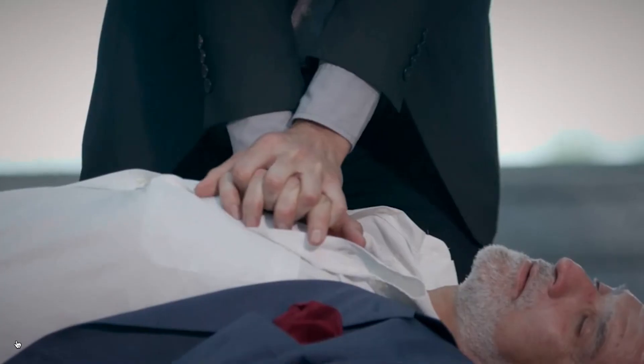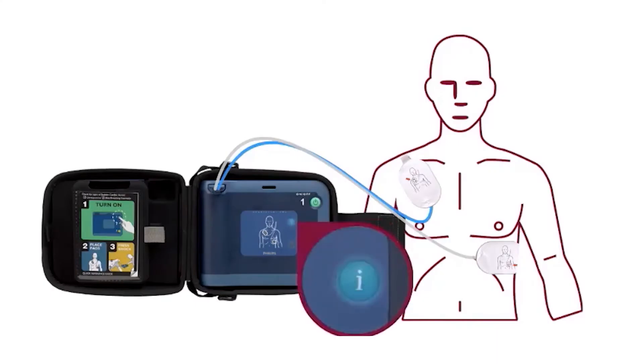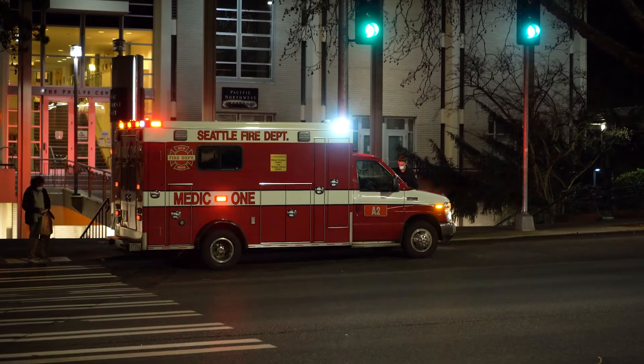If CPR instruction is needed, the user can press the blue I button to receive coaching from the device. If the HeartStart FRX determines a shock is not needed, the device will alert the user that it's safe to touch the victim and begin CPR. If the victim starts moving or regaining consciousness, obey local safety protocols until emergency medical services arrive.